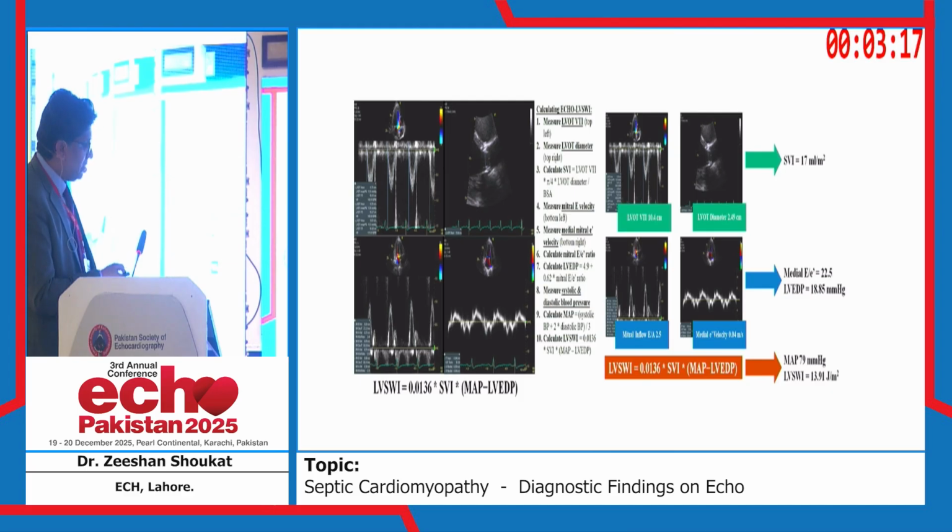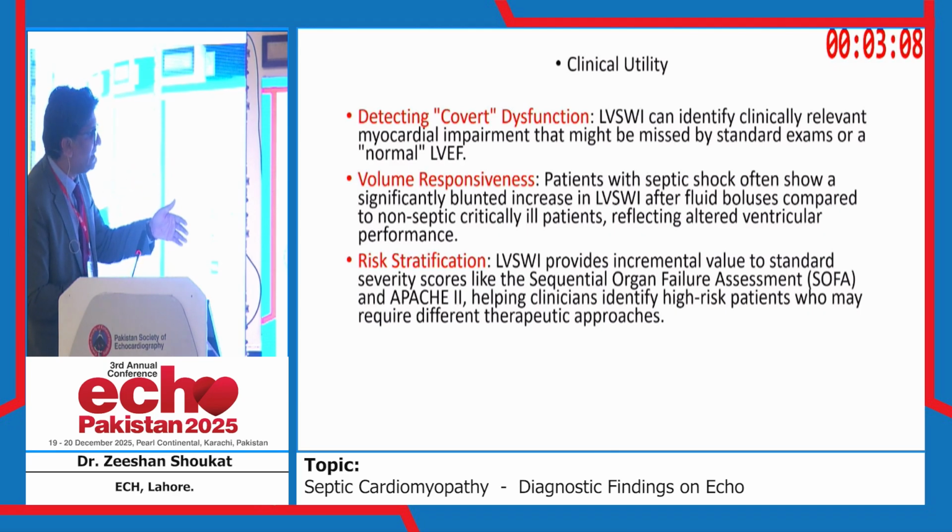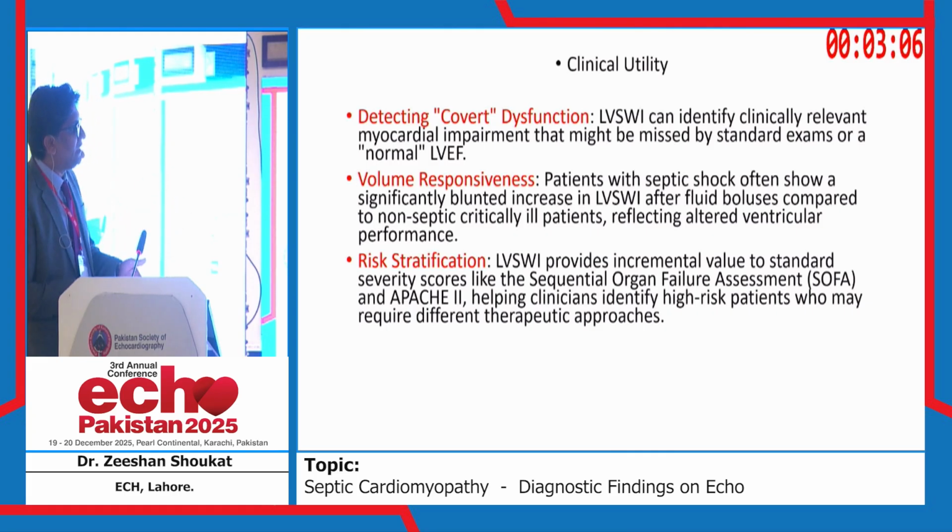It also helps with risk stratification. LV stroke work index provides incremental value to standard severity scores. It correlates with the sequential organ failure assessment and APACHE II, helping clinicians identify high-risk patients who may require different therapeutic approaches.